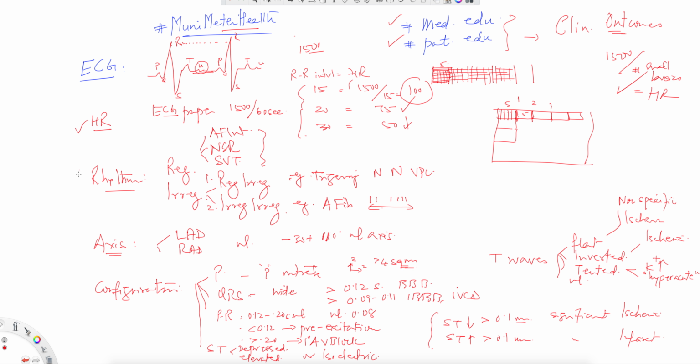Next, you've measured the heart rate, you measure the rhythm, next you measure the axis. Obviously, normal axis is anywhere between -30 to 110. Anything over 110 is considered right axis deviation. Anything less than -30 is considered LAD, or left axis deviation. So you just need to know, and then there is an Einthoven's triangle that you have to really memorize. That's beyond the scope of this video right now, but make sure you go back to the syllabus, look at the Einthoven's triangle, and try to understand how you measure the axis. You have to look at the most isoelectric complex out of the EKG, and see what's the best way to look at your axis. But the key is that you don't need to worry about the axis between -30 and +110, because that's normal axis. It's only the left axis and the right axis, or a change of axis. I always say a change of axis is important. And we'll discuss that later.